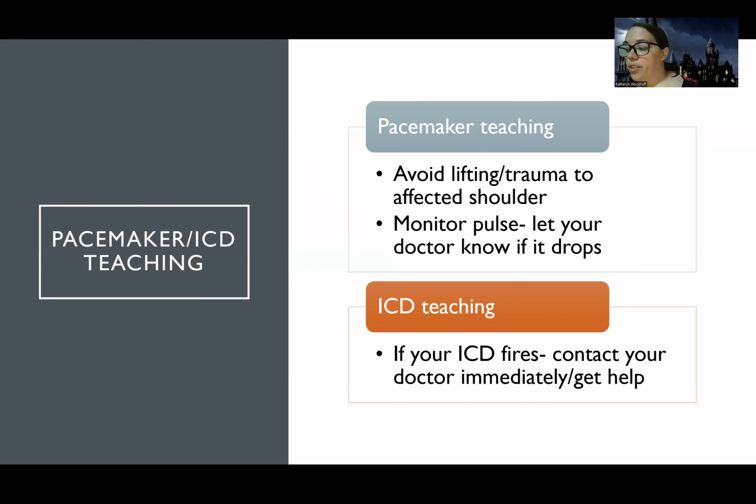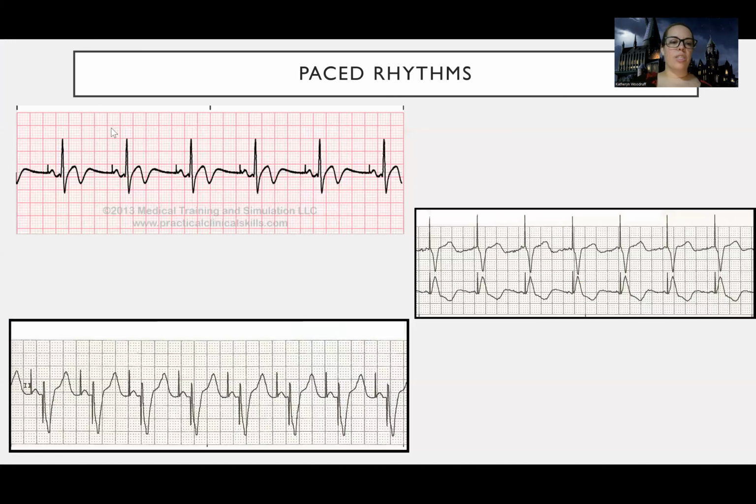Especially if it's starting to fire, then usually it's a sign that there's something that's not right. So usually they need to come in and have their heart checked out and make sure that there's not something new or different going on. This just kind of gives you an image. You're not going to be tested on looking at a paced rhythm, but I want you to know what it looks like on a strip.